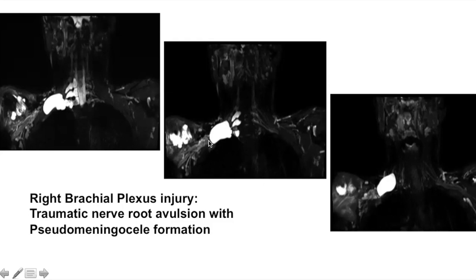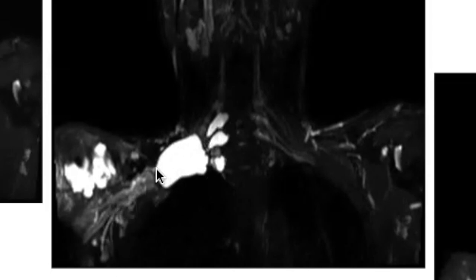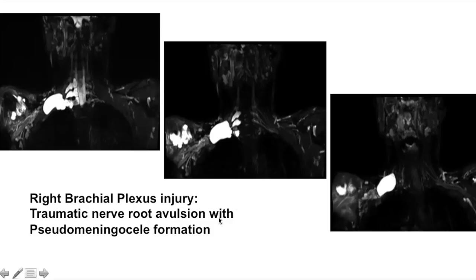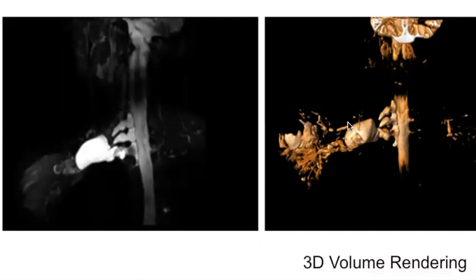These meningoceles are coalescing to form a large pseudomeningocele sac, and the nerves are retracted and edematous. We can calculate the distance of retraction of the nerves from their insertion into the cord, giving the surgeon a fair idea of the surgical procedure required. This is a classical case of right brachial plexus injury with traumatic nerve avulsion and pseudomeningocele formation. The 3D volumetric images nicely show the pseudomeningoceles and the retracted edematous nerves of the brachial plexus.